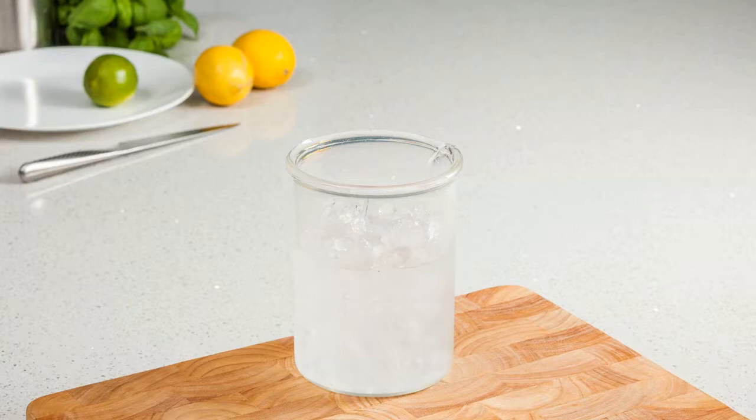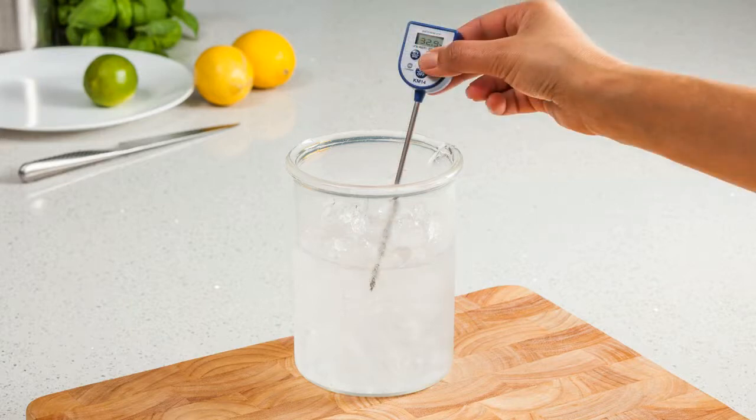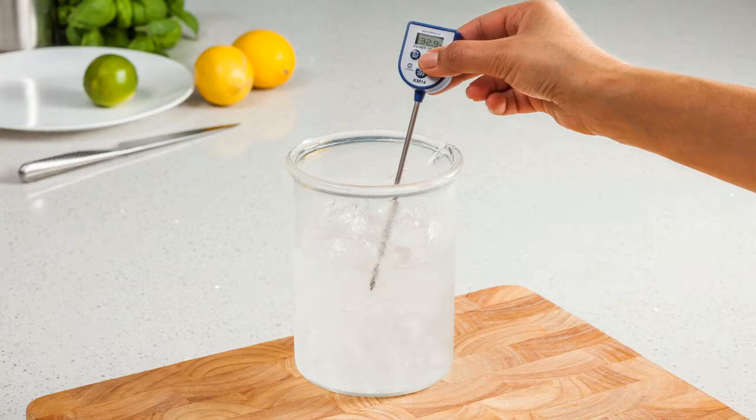To start the calibration check, simply immerse the probe of your thermometer into the solution, so that it's at least 2.5cm below the level of the water in the crushed ice solution. You should not allow the probe tip to rest on the bottom or the sides of the container.